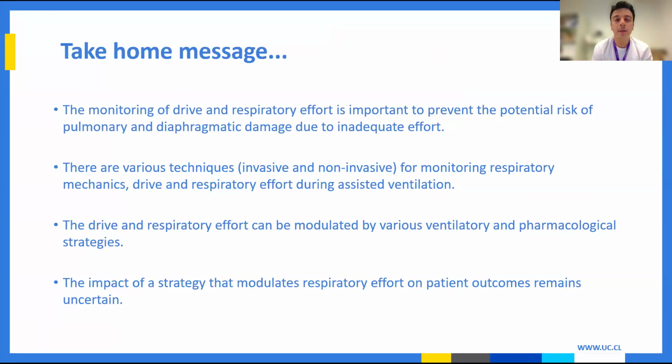So just to conclude, we need to know that the monitoring of drive and respiratory effort is really important to prevent some potential risk on lung and diaphragm due to inadequate effort. We know that now we have various techniques, either invasive or non-invasive, to monitor respiratory mechanics, drive, and respiratory effort, even during assisted ventilation.